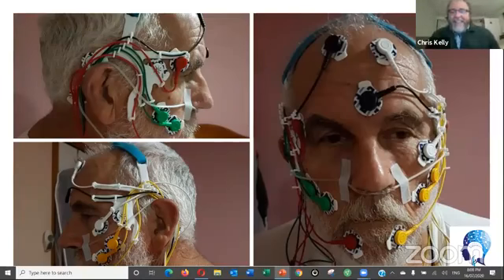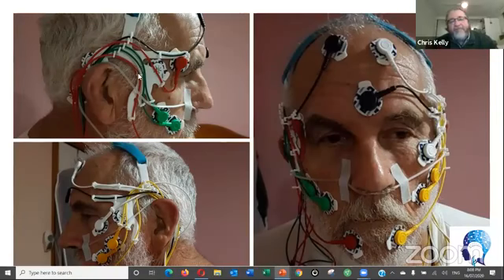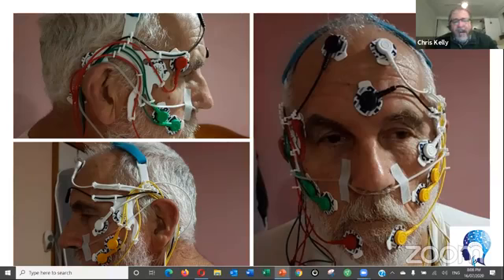But yeah, no, I don't know if you would agree or not, but what we call the air headset, this one, that thing there. When I did my original studies with you, it was a lot of hit and miss. That really makes it more comfortable, but also those leads know exactly where they need to fit, so it makes it pretty easy. And we've done hundreds and hundreds of tests now, and the headset's a new addition.